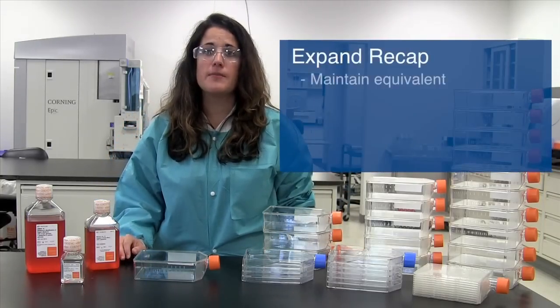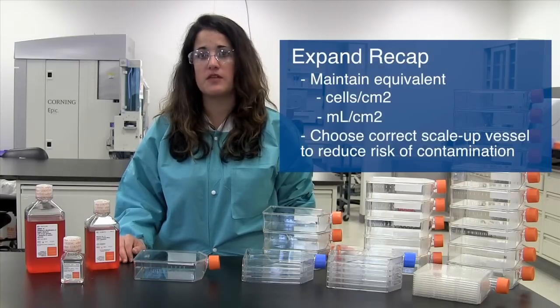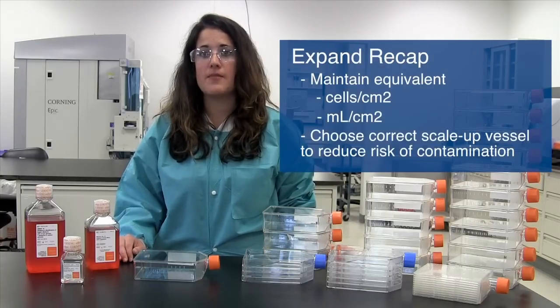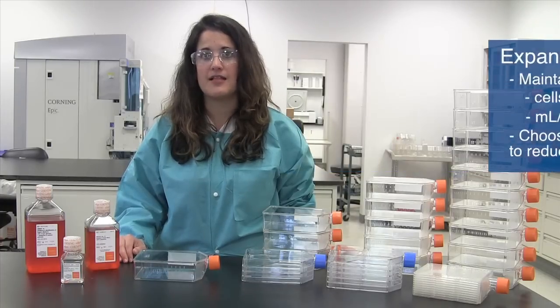So to recap: when expanding cells, remember to maintain equivalent cells per cm², mls per cm², and reduce the amount of work and risk of contamination by choosing the correct scale-up vessel.